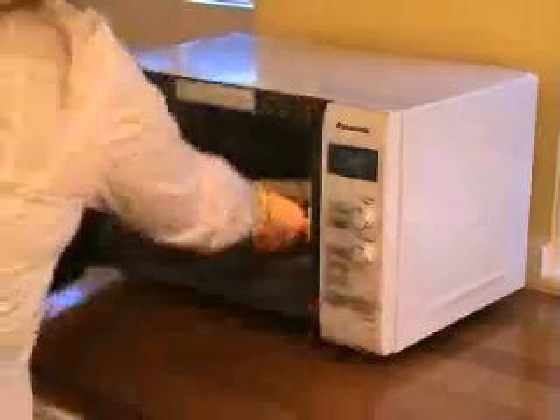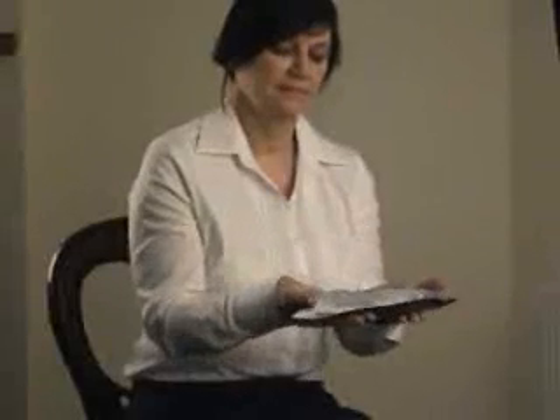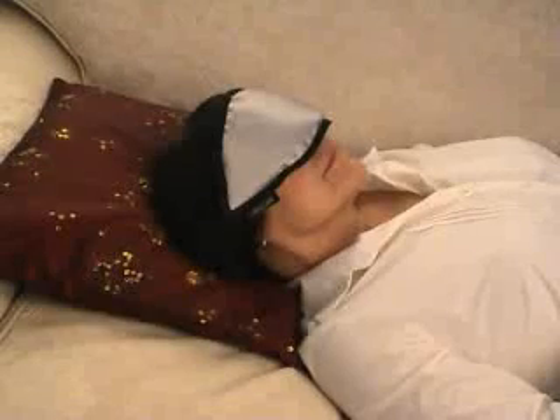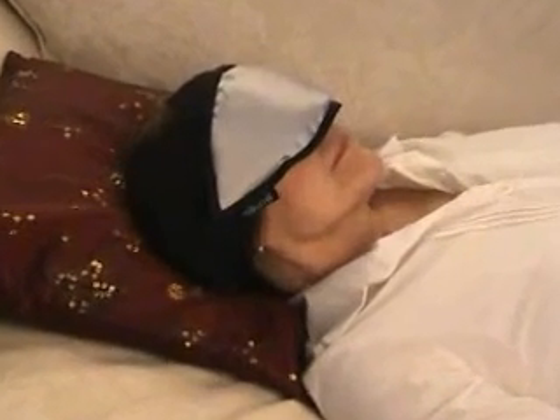Shake the bag as soon as it comes out of the microwave to make certain there are no hot spots. The silver silk side is hotter than the black side. Check the temperature against the inside of your wrist where the skin is most sensitive, and against your cheek before you apply it across your eyes. You can choose whichever side you prefer.